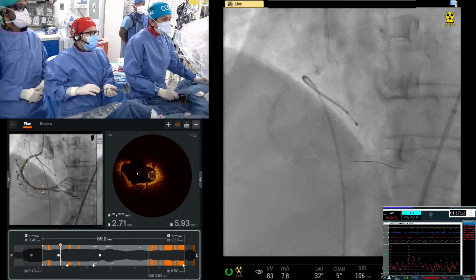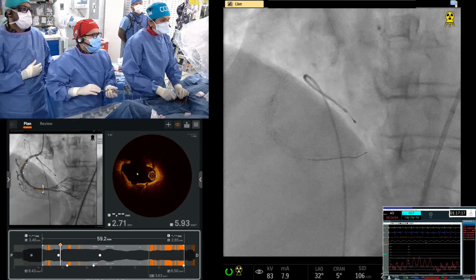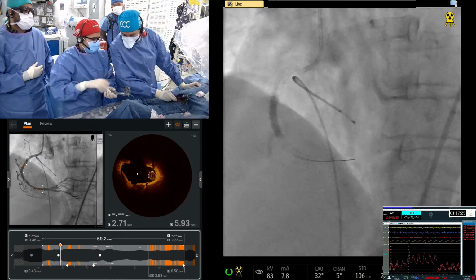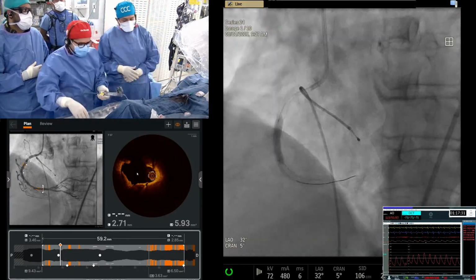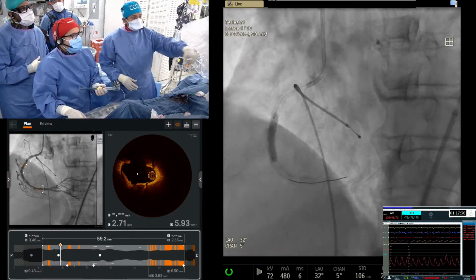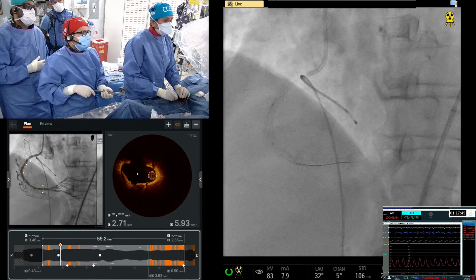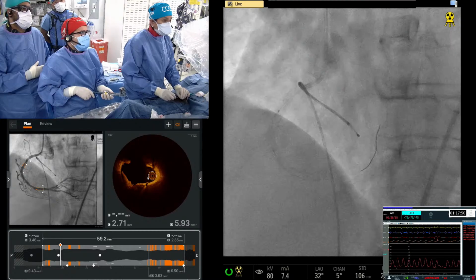This is a calcium stent, wire bias. Not a bias, yeah. Nice. Okay, now you go up here. Okay. Then I will go up. Yeah. It'll go further after that. Yes. What pressure did you deploy the distal stent at? 16? Yeah, so 12. No. Distal, we always do 12, 14. We never go more than 14 with our stent deployment. If you need, you will post-dilate. Now here, he went up to 16. It looks good, right? Now let me get the wire further down and see if I can get this a little bit further down. Like he's saying, he's worried, don't.